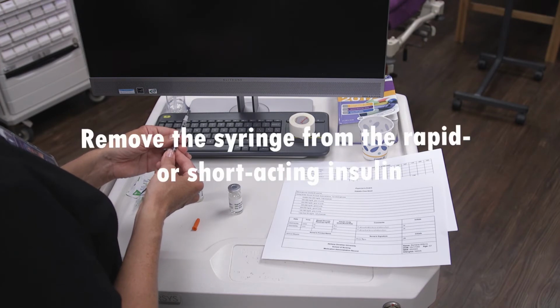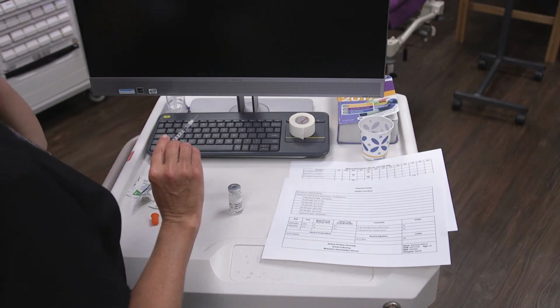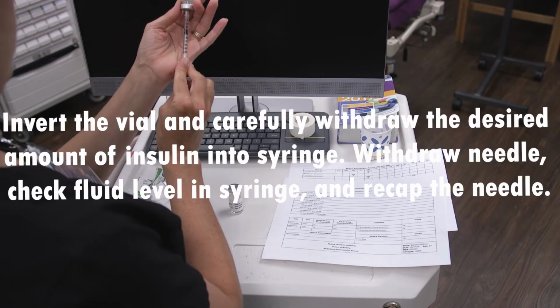Remove the syringe from the rapid or short-acting insulin. Place the needle of the syringe back into the vial of intermediate or long-acting insulin. Be careful not to push plunger and inject insulin in syringe into the vial. Invert the vial and carefully withdraw the desired amount of insulin into syringe. Withdraw needle, check fluid level in syringe, and recap the needle.